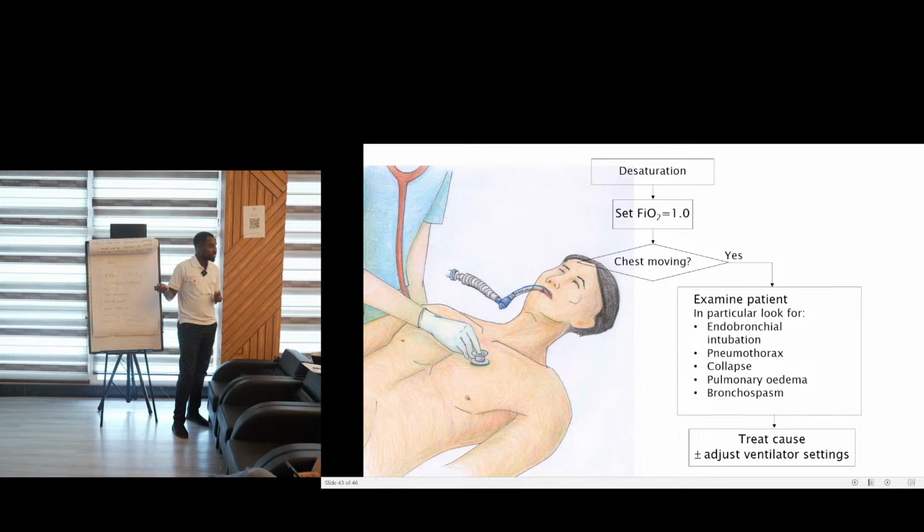The set depth. Whenever someone does HT protocol, suction or whatever, or the patient is very agitated, just a minor change of depth of the ETT could actually cause desaturation of a patient. The tube can slip in very easily towards your right side and cause endobronchial intubation.